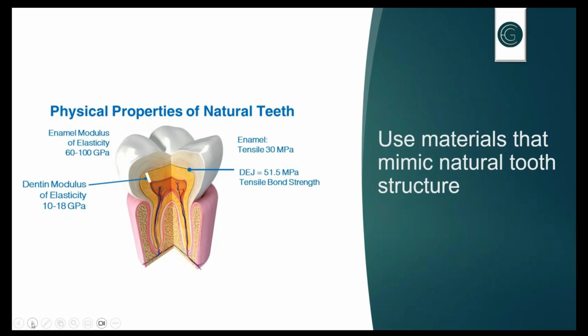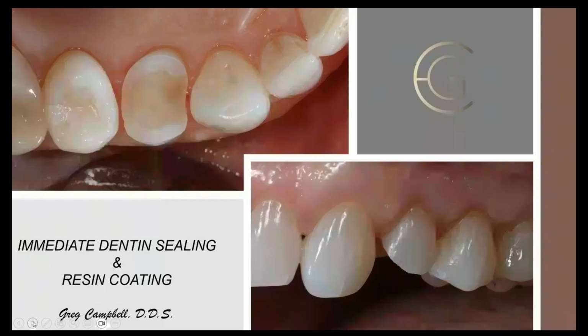And I do have this slide to show that, but I didn't bring it in today because I just want to give you some information. So had I shown you this picture before, all of you would have said that would never pass the licensing exam. You're a quack or whatever. But what I'm trying to show you is the dentin is completely sealed. Look, the dentin is completely sealed here. This is what this photo shows here.